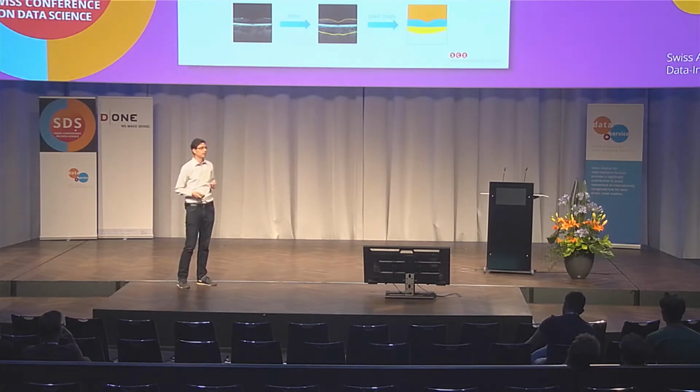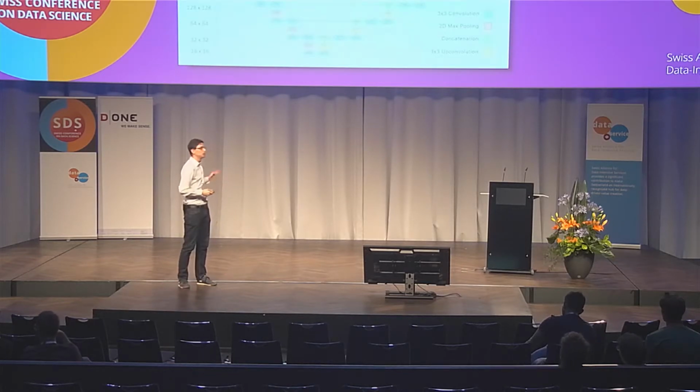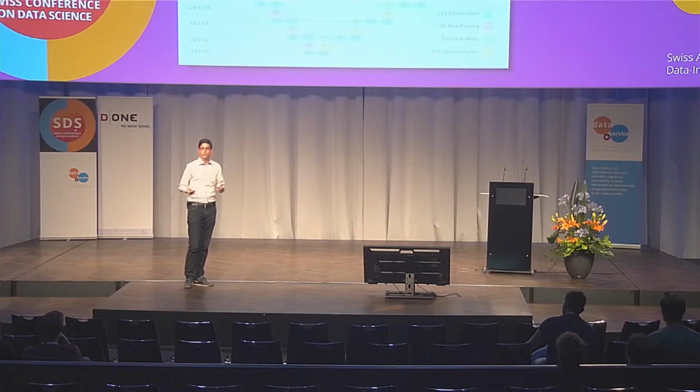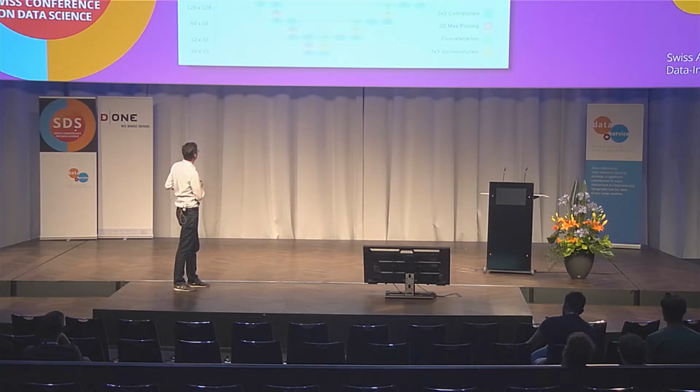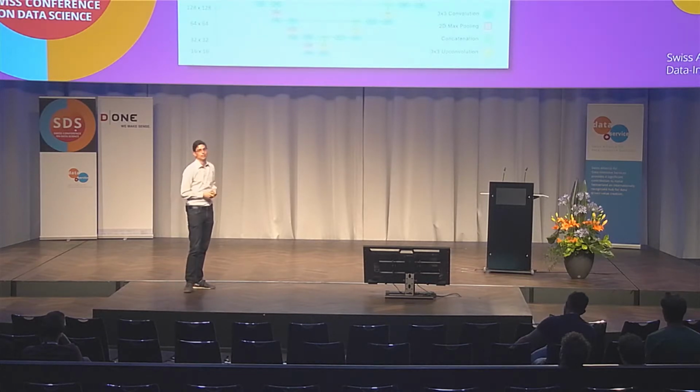Let's move on to the neural network architecture. For this task, we decided to use a UNet. I guess some of you are familiar with the UNet. It's a neural network architecture that is often used in semantic labeling tasks for medical applications. I mean, the U in UNet derives from this U shape, which you can see here. And basically, what we do is we take raw OCT images, we input them to the net, then they are processed through the net, and as an output, we get these semantic segmentation maps.